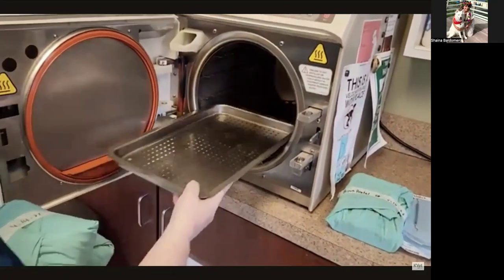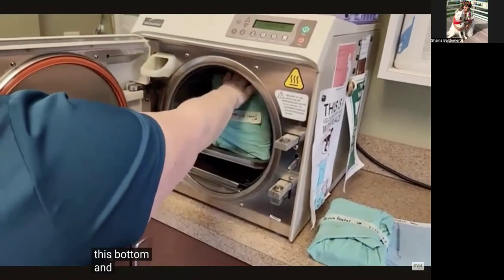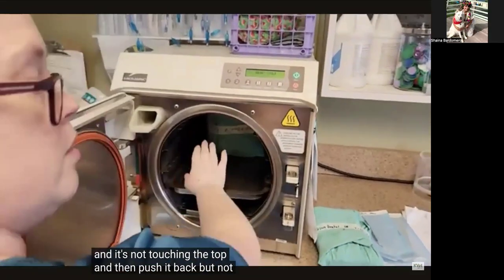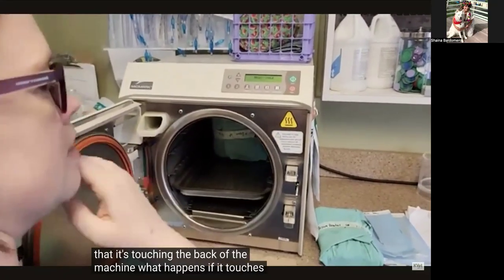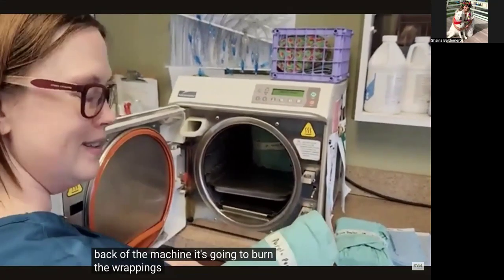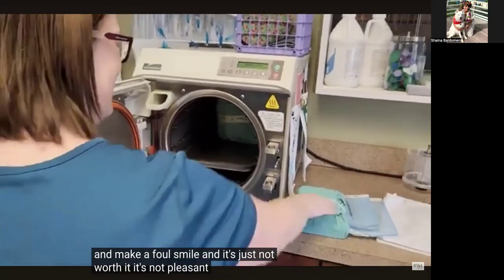I'm going to just sit it at the bottom, and it's not touching the top. And then push it back, but not so far that it's touching the back of the machine. What happens if it touches the back of the machine? It's going to burn the wrappings and make a foul smell, and it's just not worth it. It's not pleasant.